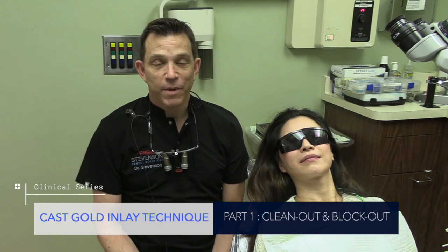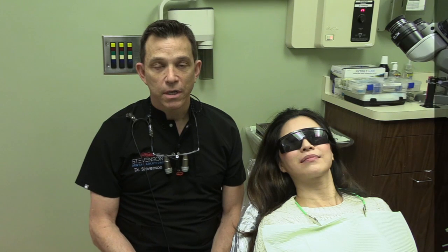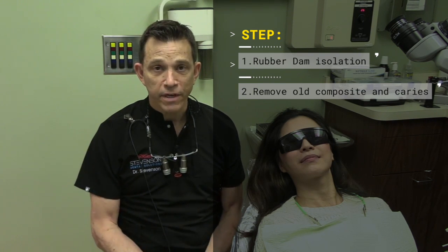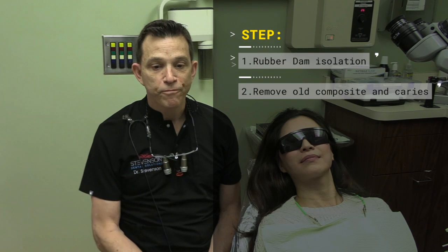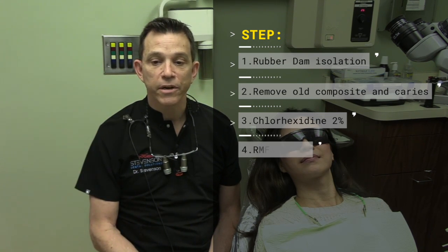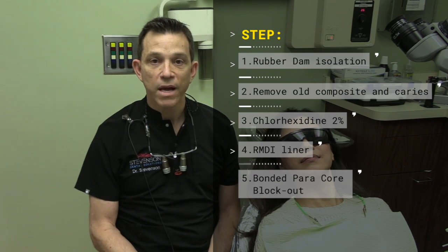Just to sum up, I'll go over what we did today and what we accomplished. We were able to isolate tooth number three with the rubber dam, isolating from 2 to 12. Then we were able to disassemble the old composite, which had a significant amount of decay underneath it. Fortunately, the decay wasn't so deep. After that, we utilized Chlorhexidine to kill bacteria, followed by Glass Ionomer in the deepest area. After that, we used a bonded Paracore block-out.